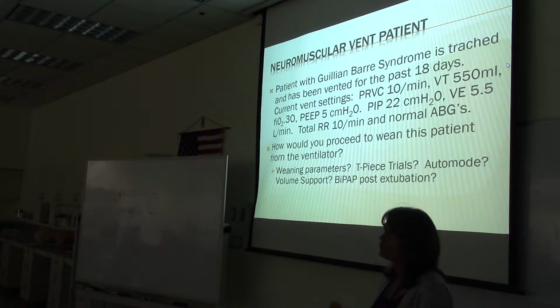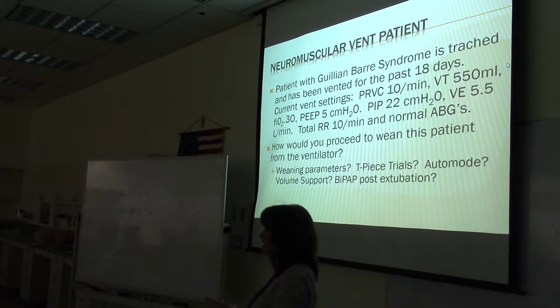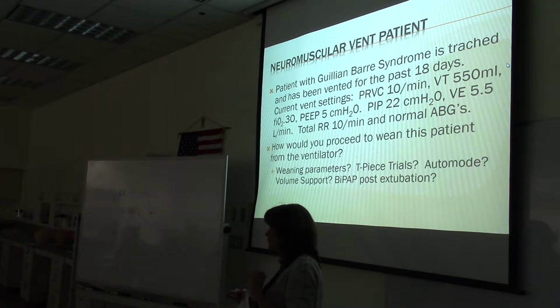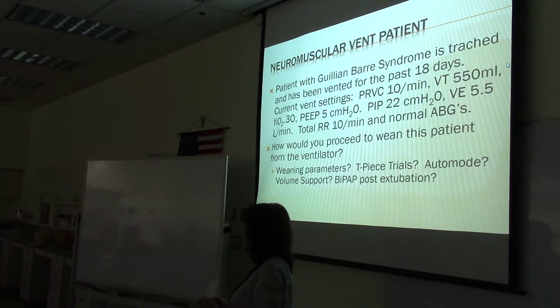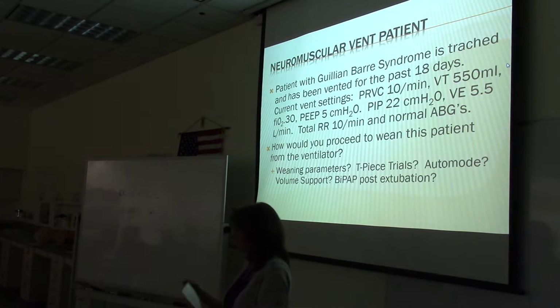When you're doing a negative inspiratory force, if you do it during the first breath, you usually don't get the patient's best effort. To get the best effort, it's recommended that you occlude their airway for 15 seconds. To me, that's a little bit on the dramatic side, because yes, by 15 seconds of an occluded airway, they're going to be struggling, and you're going to get a very deep negative pressure. But the point is, at least 2 or 3 breaths. Don't just have them do it once and then write that value down, because they may not be participating as fully as possible, and you're not getting an accurate number. So stress them a few seconds at least to get that extra effort, and then measure their negative inspiratory force.